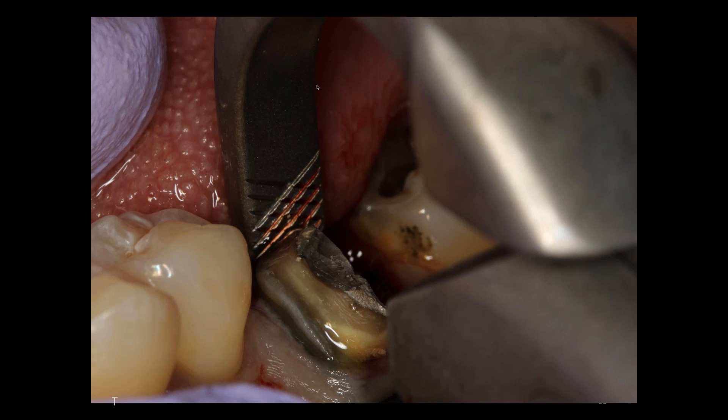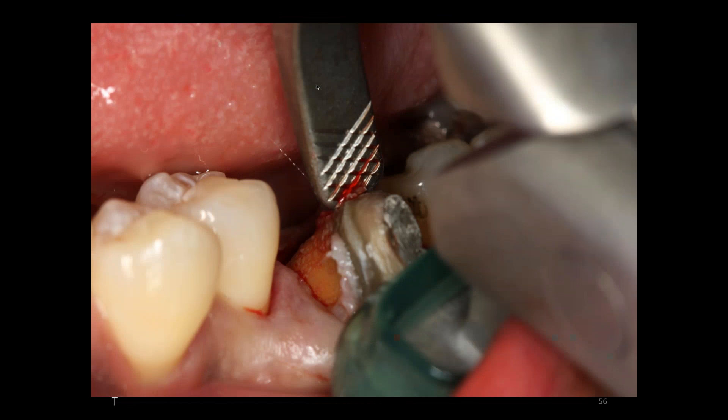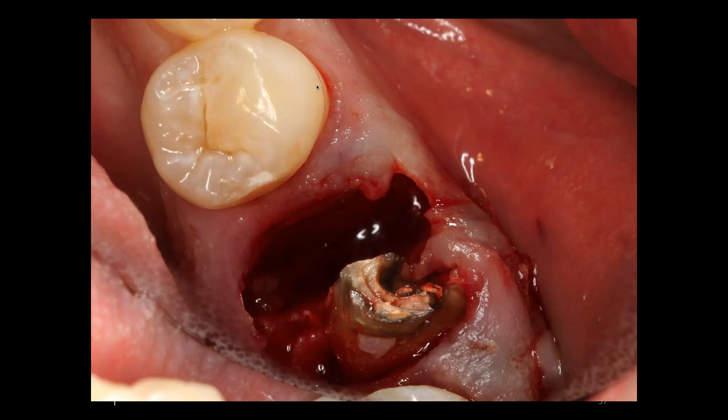In these situations I will graft this site with one of the materials we'll demonstrate in a few minutes, allow it to heal, and then I can very predictably place an implant. It will prevent bone loss and maximize the amount of bone I have for my eventual implant. Here we take our tooth delivery instrument and remove the roots in total.